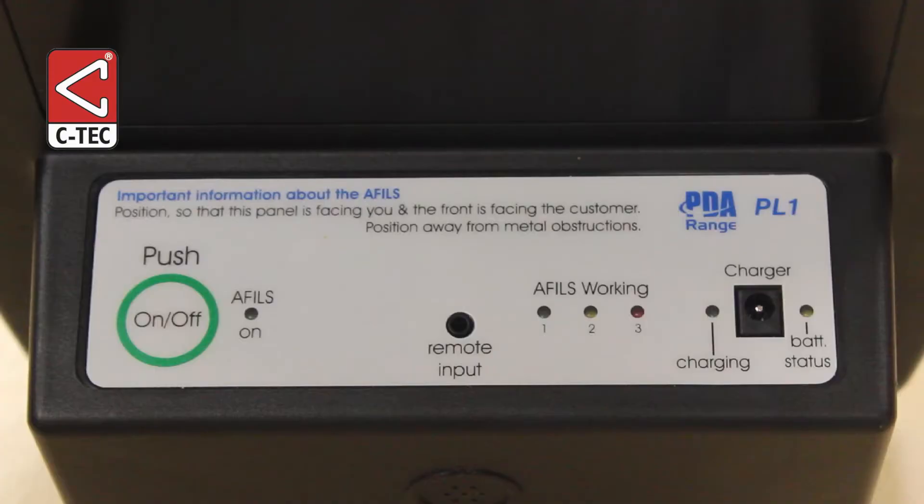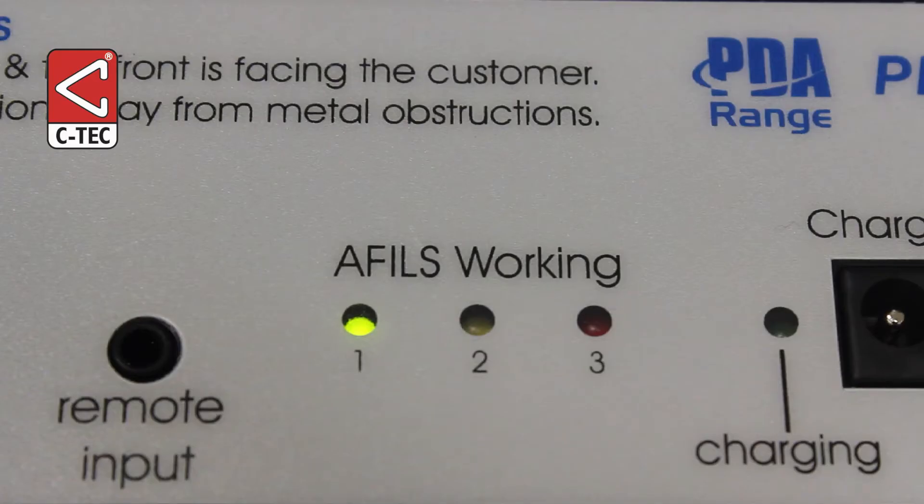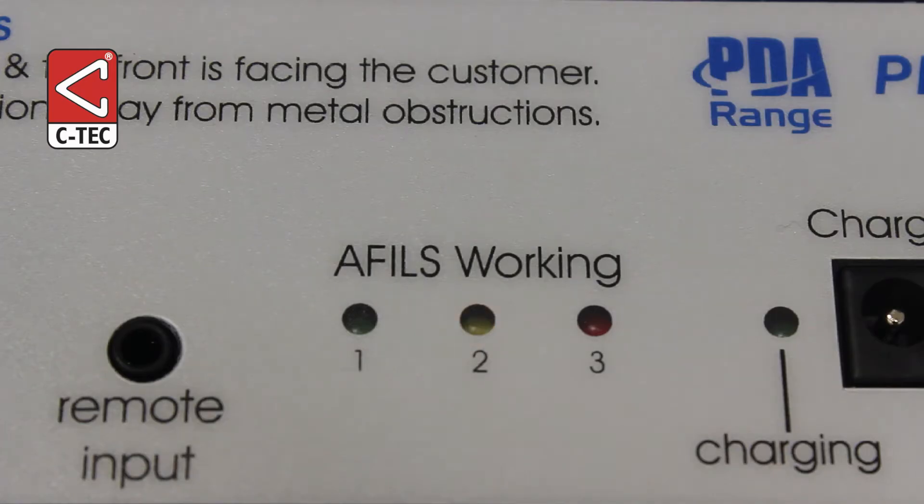To do this, make sure the amplifier is powered down, then press and hold down the on/off button and watch the AFIL working indicators step between 1, 2, and 3. Let go of the button when indicator 1 is lit to set the default time to 10 minutes, let go when 2 is lit for 30 minutes, and let go when 3 is lit for 60 minutes.